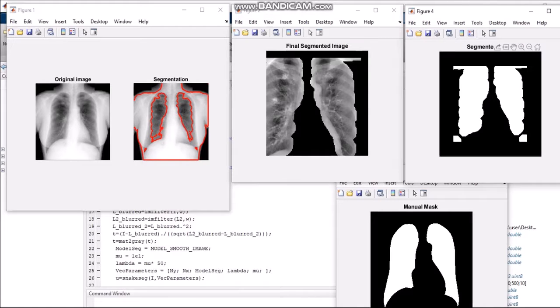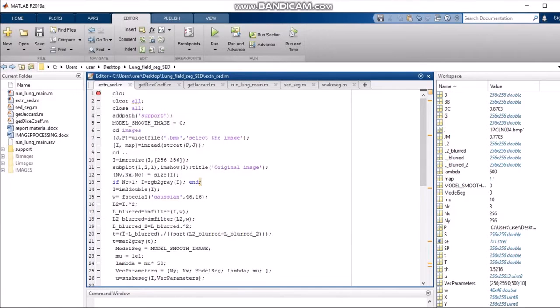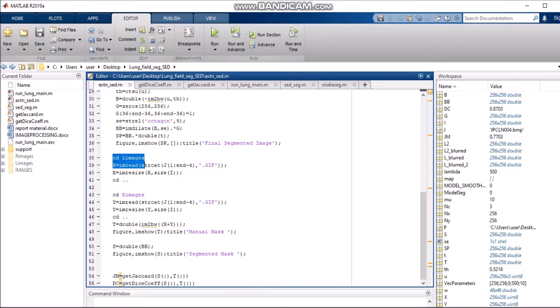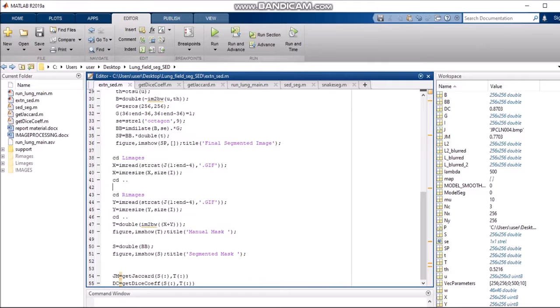We change the directory to L images and R images. L images account for the left side of the lung from the dataset, and R images account for the right lung images from the dataset. The code changes to the left images first, reads the images, converts them to the same size as the input chest X-ray, and then does the same for the right. The X variable and Y variable account for the left and right images respectively, and adding both of them gives us the manual mask.